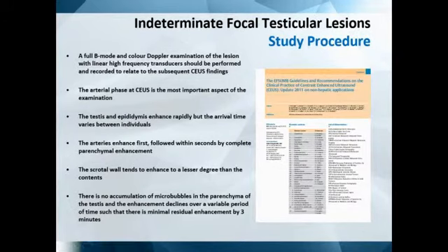We've heard earlier on from Helga that when you're looking at small parts, testes, bowel, thyroid, and whatever else, you use the full dose of contrast. So you have to use the 4.8 mils of SonoVue, and this is due to the physics of the resonation and the size of the bubbles. Prior to doing the examination, you should do a full B-mode and colour Doppler examination.